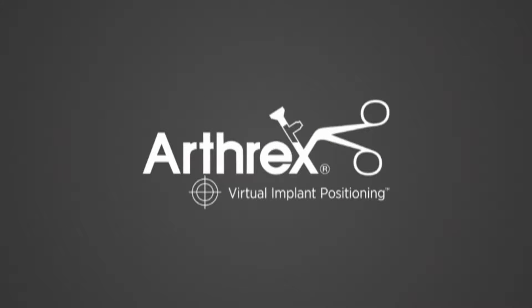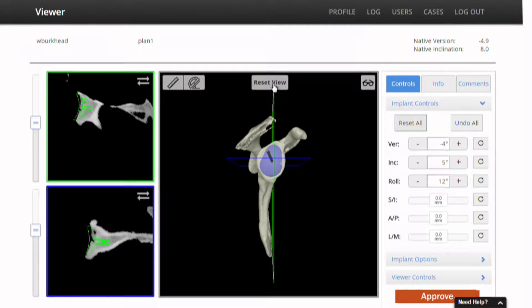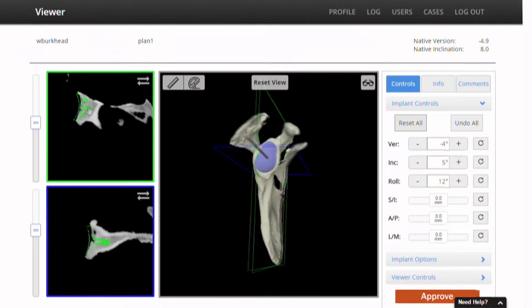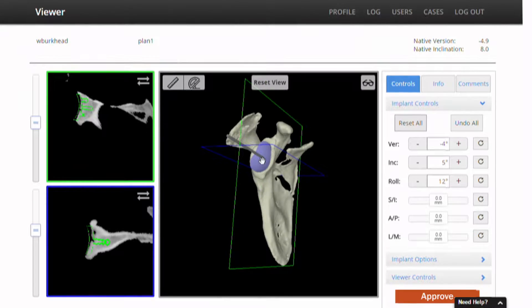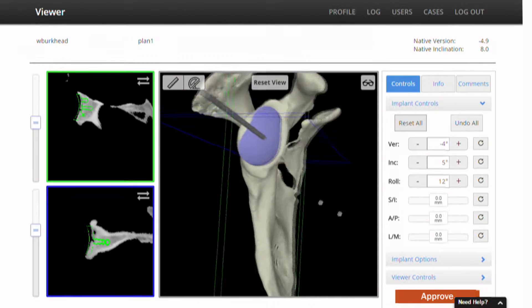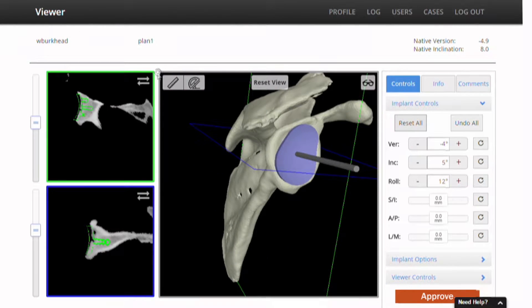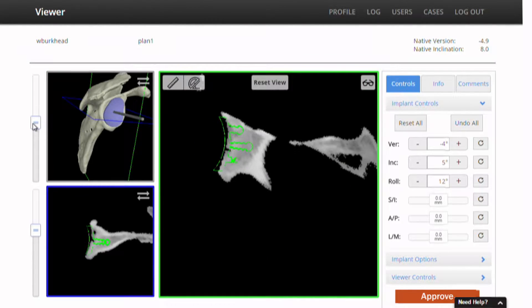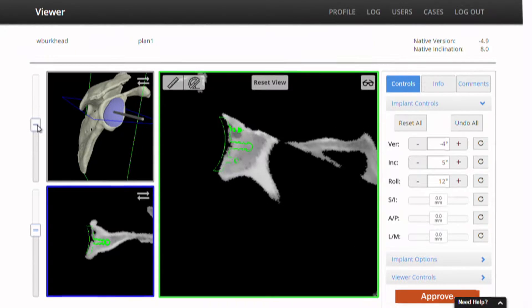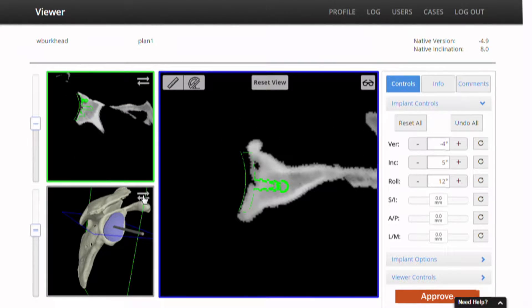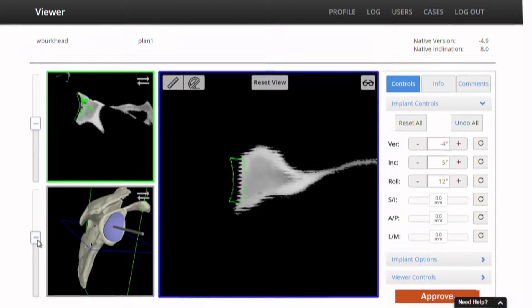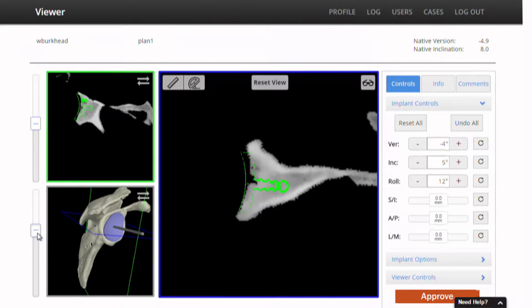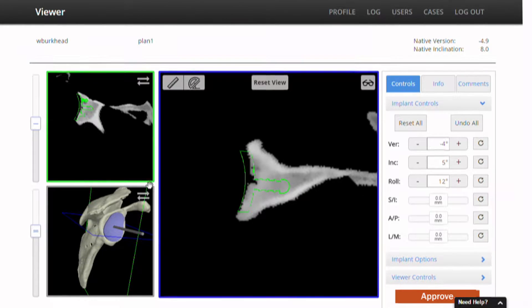Hi, this is Buzz Burkhead. I'm at the Carroll Clinic Center. This is the Arthrex VIP planning platform and we pulled this up and here we have a 3D model. This is real-time. You turn in a CT scan that's a one millimeter slice CT scan and then within 24 hours you get notified that the plan is up and then you're able to customize it at will. It's a very flexible, very user-friendly platform.